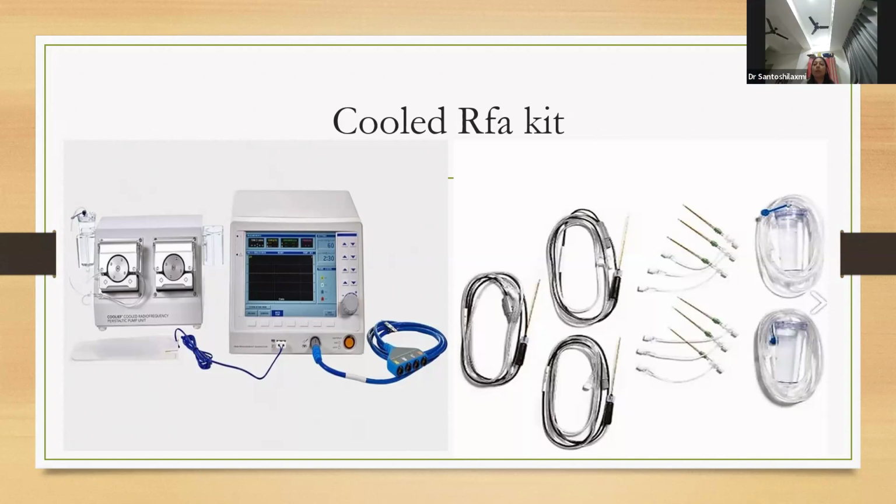Second point, what is the difference? Temperature. Conventional RFA has got temperature limits. There is a limit for the temperature, and it is around 70 to 75 degrees Celsius. But here, without increasing the temperature, we can increase the size of the lesion by flow of the water around the cannula. Can you explain this?